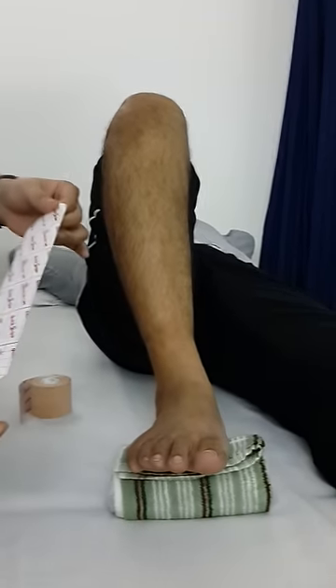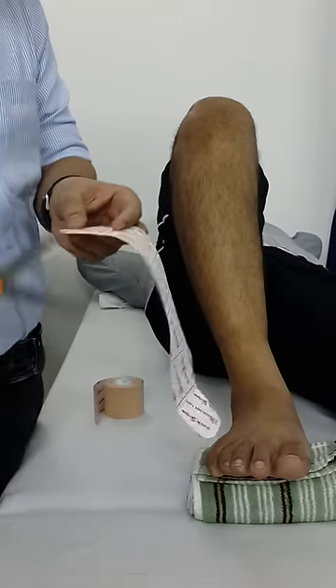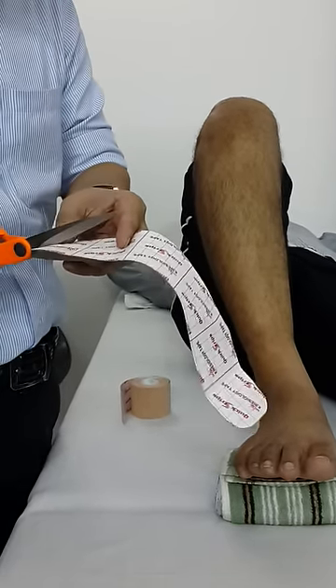Then you have to take a strip — a kinesiology taping strip like that much. Then you have to cut it a little bit like a Y-strip.